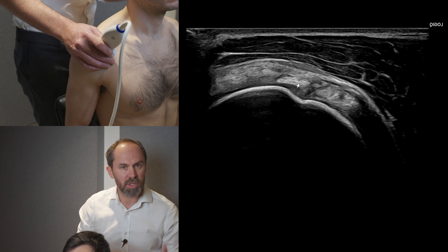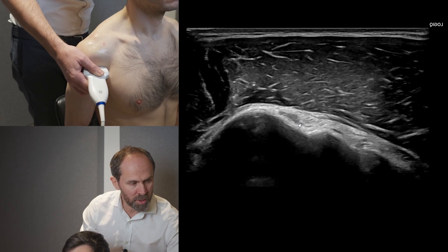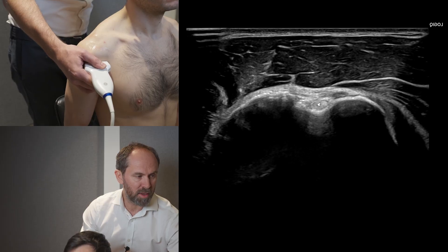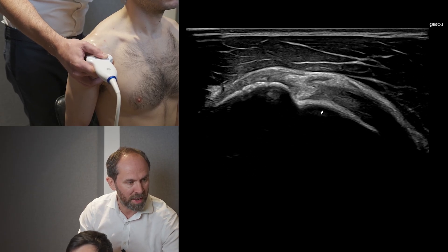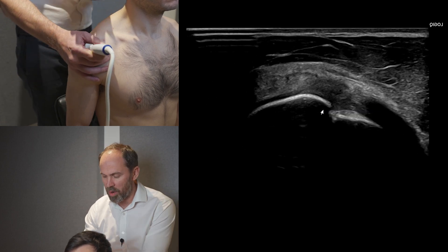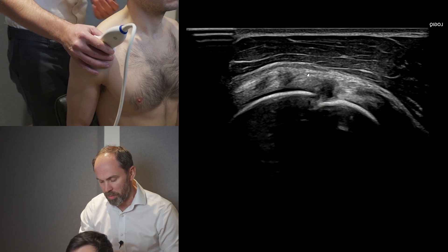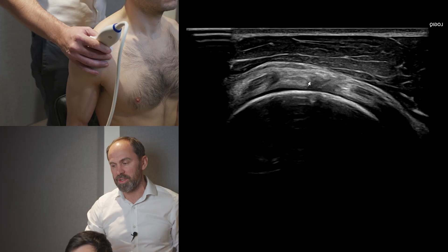Let's do the transverse biceps scan once more, following from the pec all the way up, keeping the bone bright and the tuberosities level. As we come up, we look for the lesser tuberosity to fall away — that indicates a change of direction of the biceps. The lateral side of the probe comes over, taking the probe wire from horizontal to vertical, and we're in the rotator interval. You can see a little bursal plane there, and with the patient moving the hand in and out you can see the biceps tendon move. Remember: one view is one view too few, particularly if you're looking for pathology.